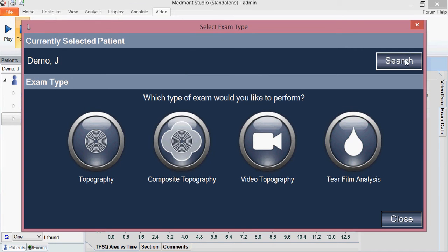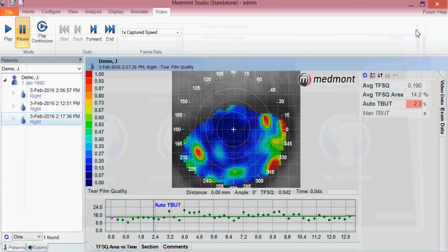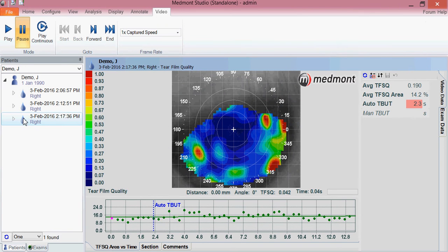The capture will automatically be saved to the patient file. We can see that here, highlighted by a teardrop-appearing icon which indicates it's a tear film surface quality analysis. We can look at the image not in terms of the shape of the eye, but in terms of the quality of the tear film.